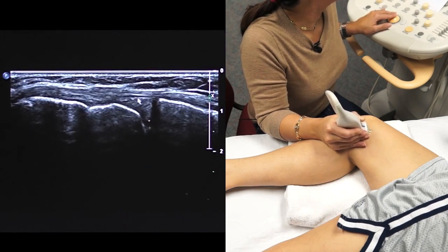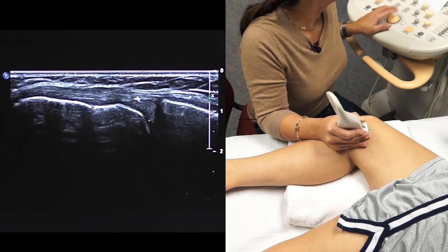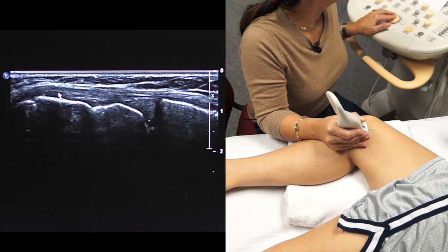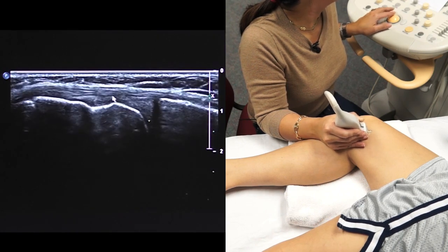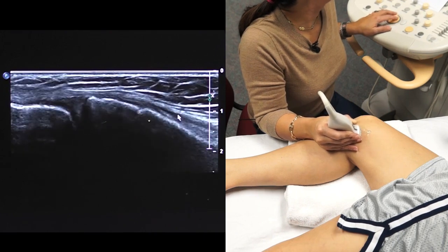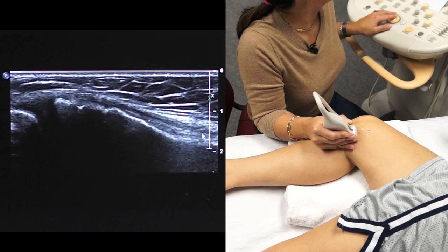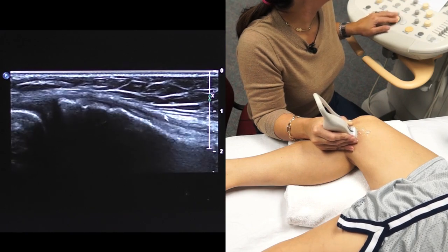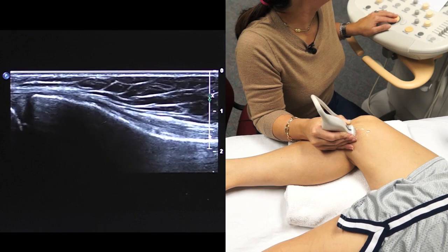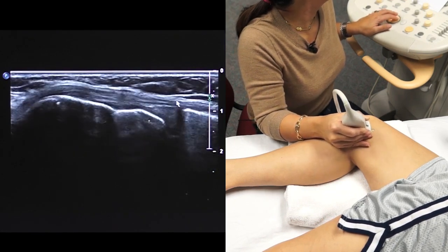Overlying that is a linear structure which extends from the distal femur and over the medial meniscus. You want to make sure that you examine the entire structure because it actually extends down lower than you think. You can see this band extending all the way down past the proximal tibia, and that is the medial collateral ligament. And here we are again in the medial collateral ligament.